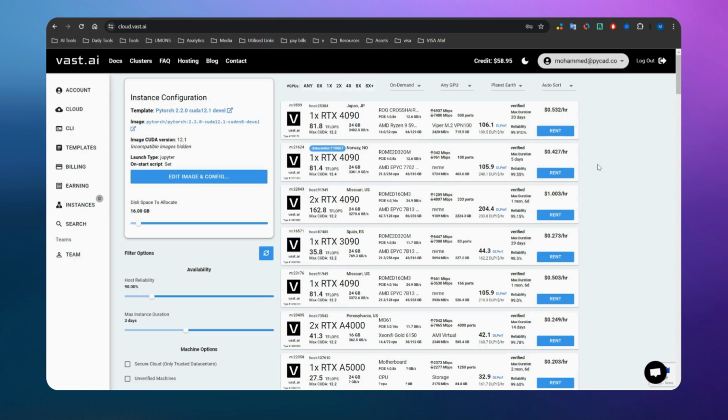Don't worry about nnunet, and with the course we will not surpass the 5 days. It will be just 2 or 3 days as maximum if we take a lot of time. But you can do everything in one day if you do the process step by step. Then you don't need to care about the 5 days. Okay, so this is for the people who will use the Vast AI. If you don't want to use it, then you can skip the whole part here.